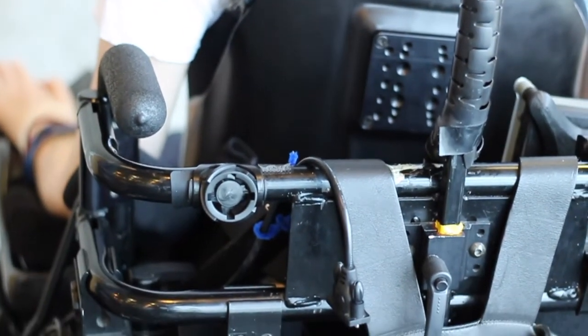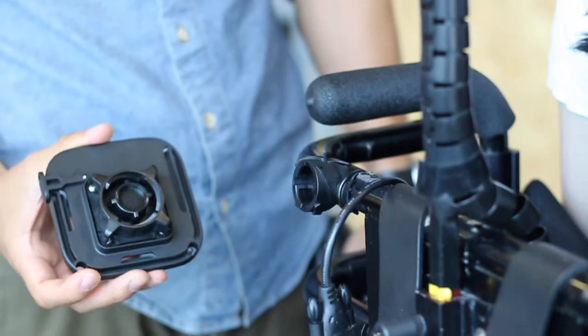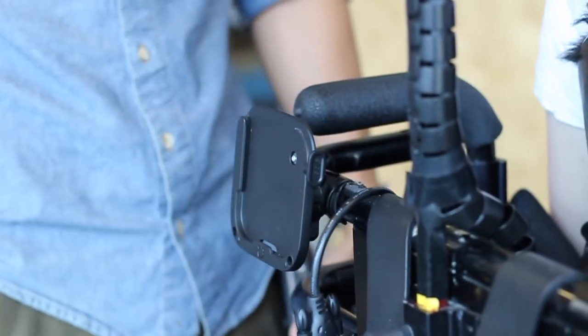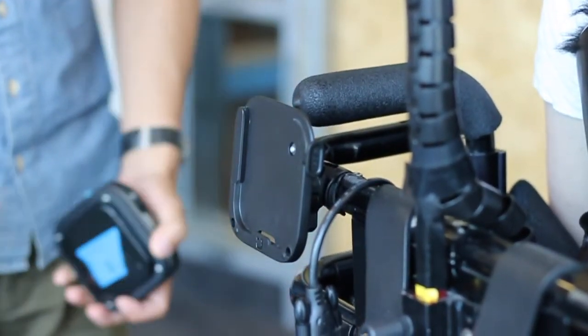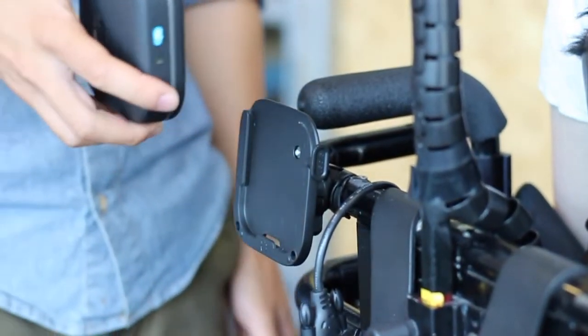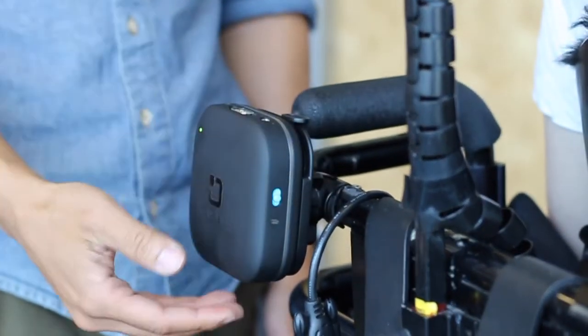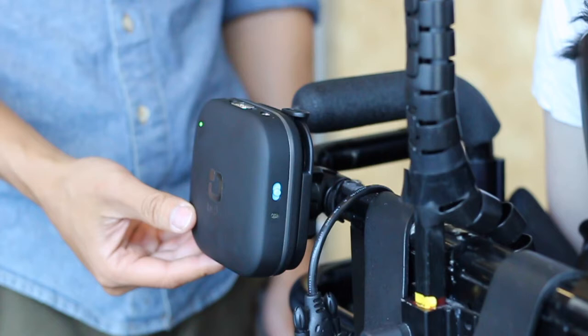After this is done, you may now attach the Tekla-E wheelchair mount. It magnetically fastens to the tubing mount and may require a quarter turn of the dial on the back of the mount. Once this is done, slide the Tekla-E into the mount from the top and rotate the locking tab up to secure the Tekla-E in place.